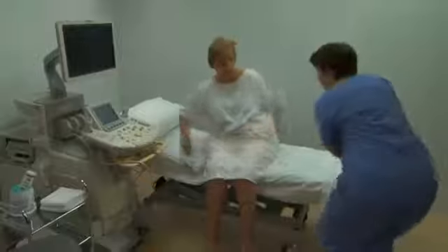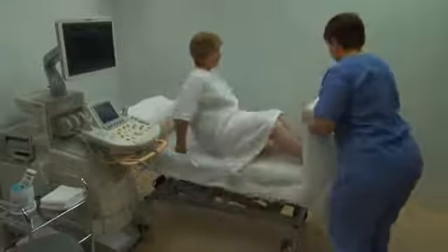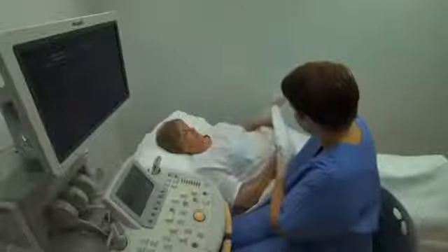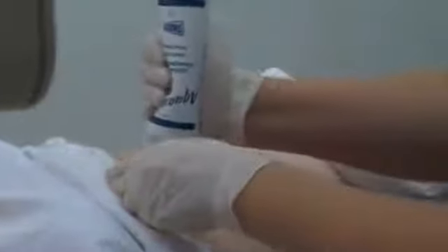Explain the technique of breath holding and, if necessary, the Valsalva maneuver. Ask the patient to lie supine on the bed and make them comfortable with the use of pillows or wedges positioned as required. Put on gloves. Expose the patient's abdomen and apply acoustic gel to the right lower costal margin.